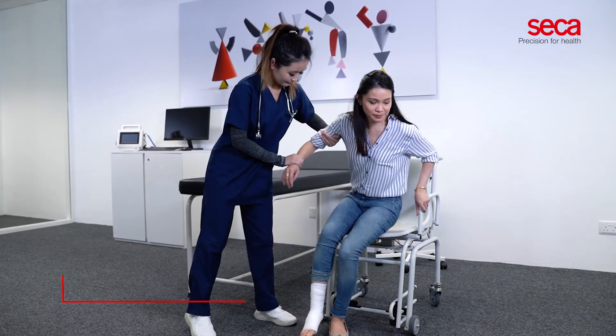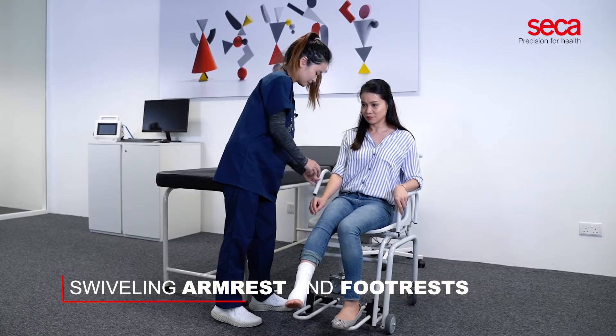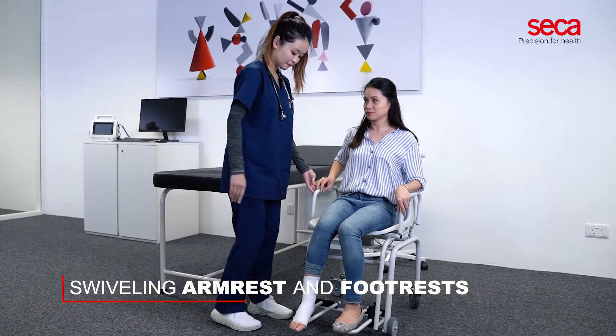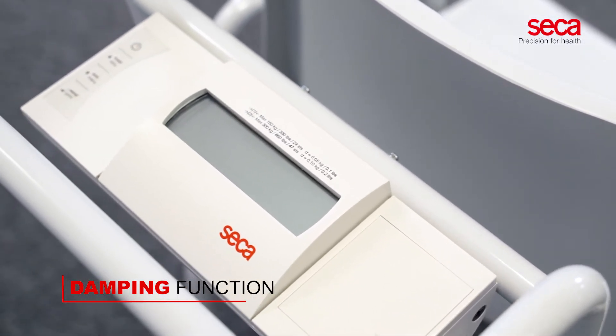The swivel armrest and footrests ensure comfortable transfer of patients from wheelchairs or beds. The damping function allows the large display to show a stable weight value.